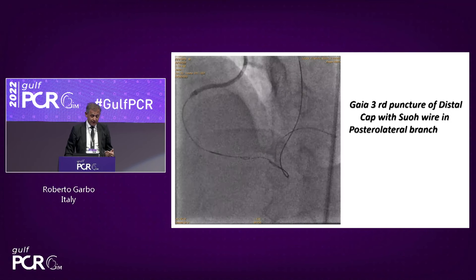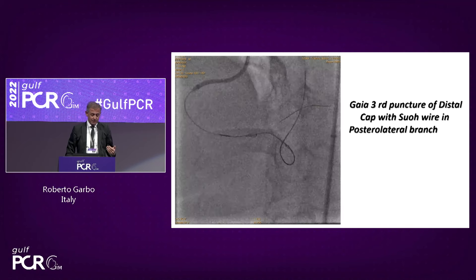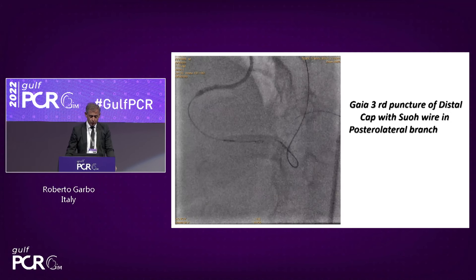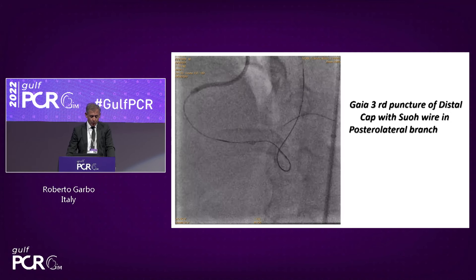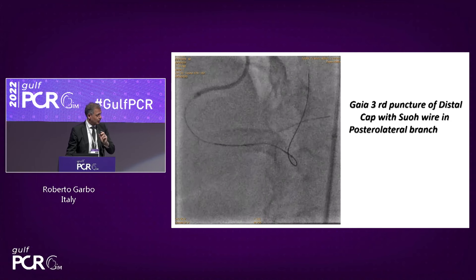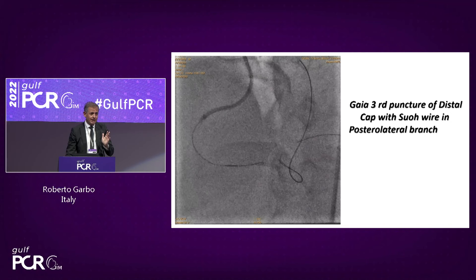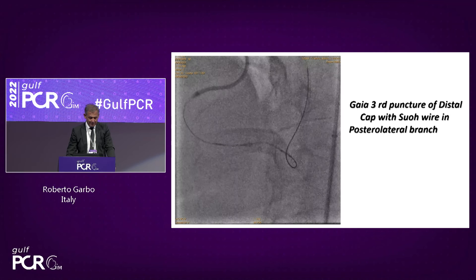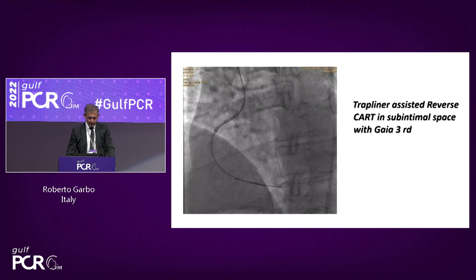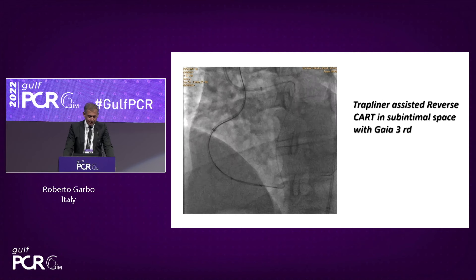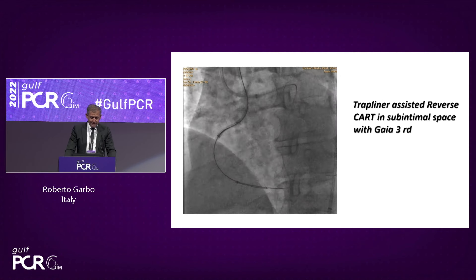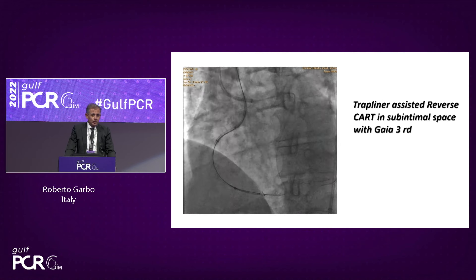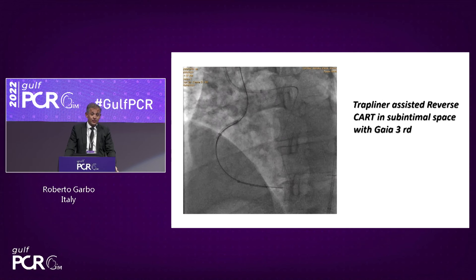This is the Gaia 3 puncture of the distal cap, with the Suoh wire in the posterior branch. From antegrade, the Gladius marker wire is visible, so we know exactly where to puncture from retrograde. We are in the same space. Then from antegrade, I used a Trapliner for a Trapliner-assisted reverse CART. With a guide extension, it is much easier and faster to make the connection — in the past, 15 years ago when we started retrograde CTO, you had to advance all the way to the proximal right.